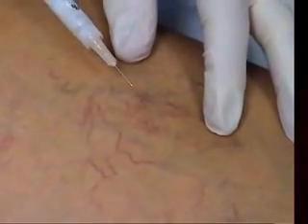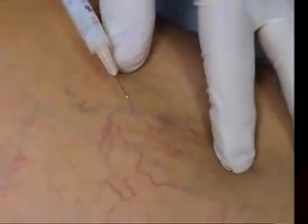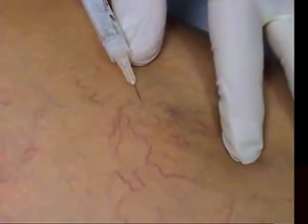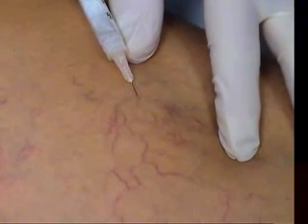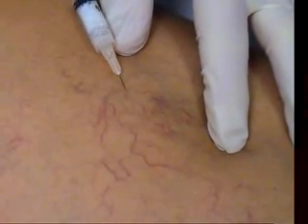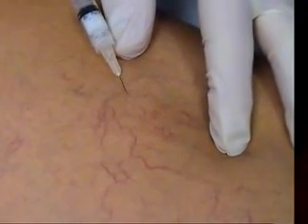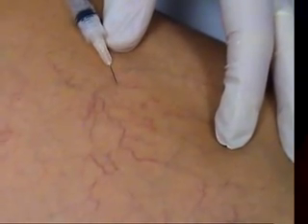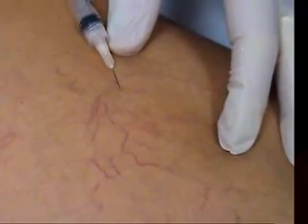Okay, bevel up, slightly bent here. A number of locations we can go. We can go in here, for instance. Skin on the stretch a little bit, needle in that vessel. I think you can see pretty clearly I'm injecting. You see that disappearing there? And I'm always looking at the tip of the needle just to make sure there's no extravasation right at the tip of the needle there.